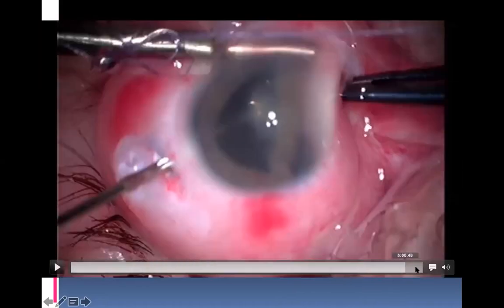And then we reached a point where we could separate this retinal fold from the overlying chorioretinal scar, from the vitreous scar, and by just doing a vitrectomy at this point, we could identify the membrane and isolate it from the retina. Very meticulously and very slowly, and you had the idea that, yes, I found it. This is a toxoplasma scar that was really adherent to the surrounding tissue. And we finished the dissection. We were extremely lucky to identify the membrane.